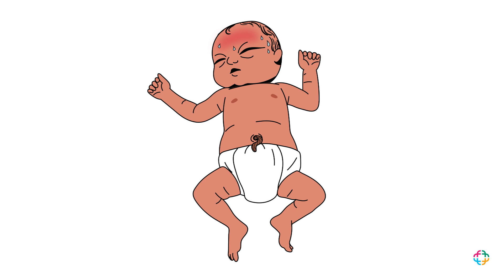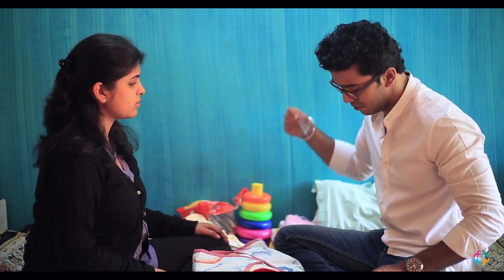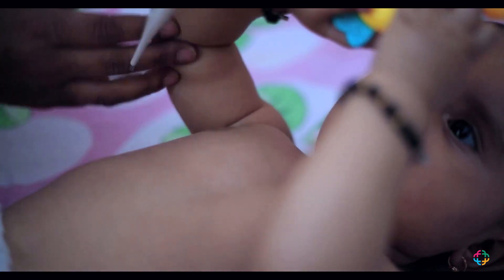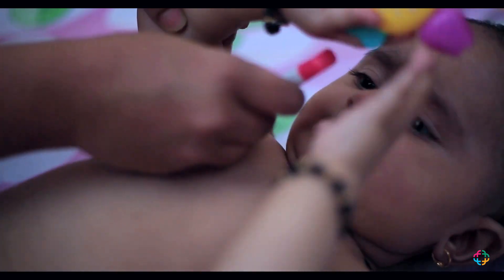First, we have to keep the baby warm throughout the procedure. We need to use a clean thermometer and shake it down to less than 95 Fahrenheit, unless we are using a digital thermometer. Then place the thermometer bulb high up in the middle of the armpit.